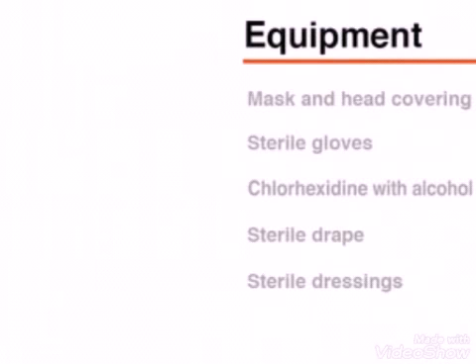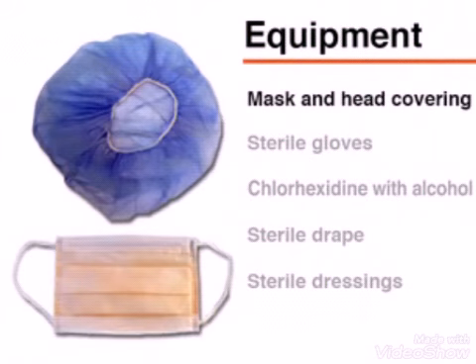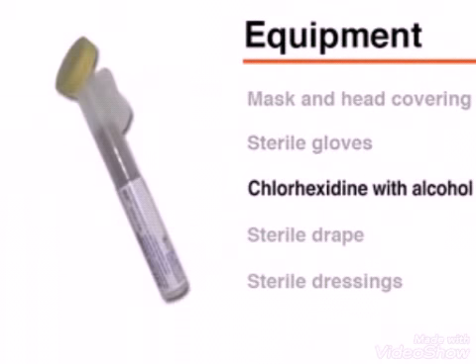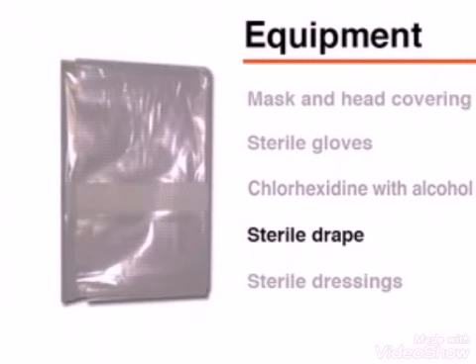In addition to the contents of the kit, each person present at the procedure will need to don a mask and head covering. You will also need sterile gloves, an antiseptic skin cleanser, preferably chlorhexidine with alcohol, a sterile drape, and sterile dressings.